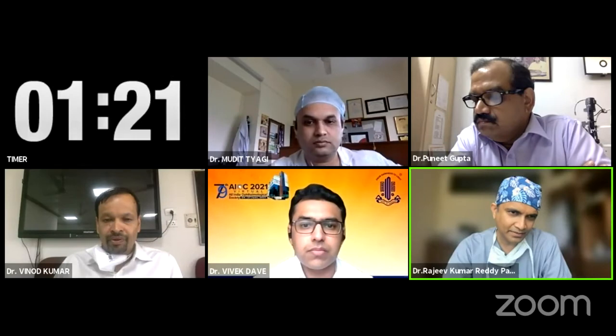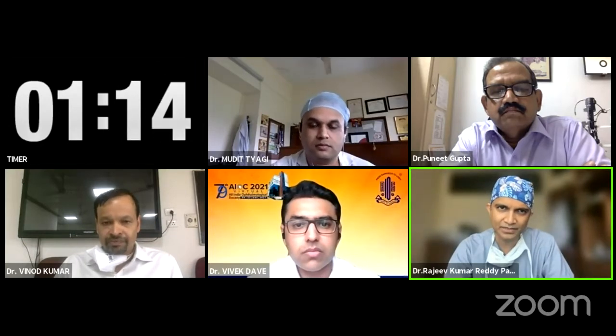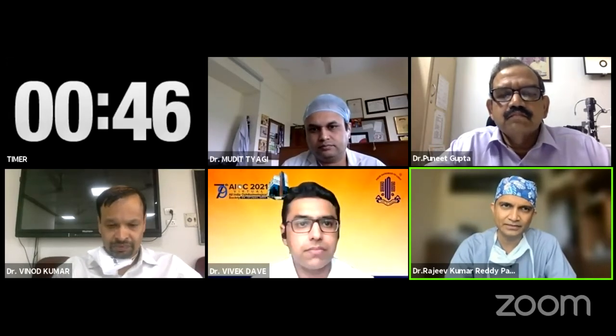Correct. So there is a variability to this. I would not give too much importance to the disc pallor per se in case of an assessment of the disc using an endoscope. I would go more with the structural changes. How much of the disc cupping are you seeing? How much of the neuroretinal rim is still there is what I would give more importance to. So the pallor is a little variable. You can still see it sometimes if you have multiple sclerosed vessels around the disc and you see a pallor, that's an obvious thing. But if it's borderline, I would go with structural changes rather than the pallor.